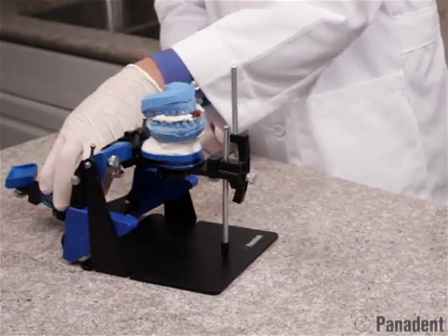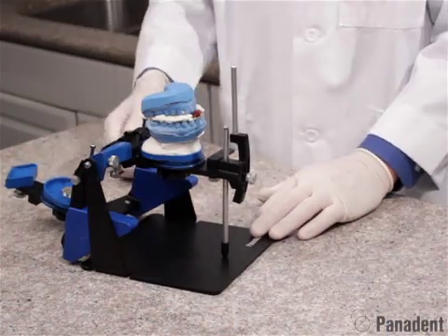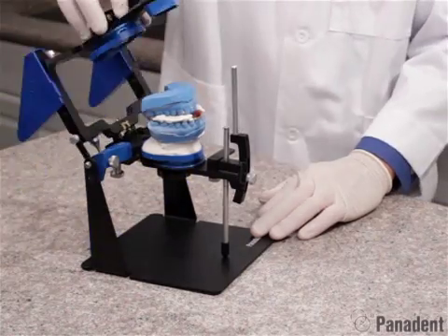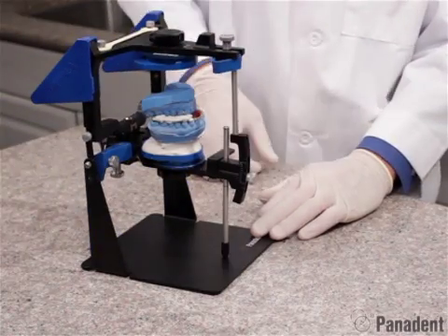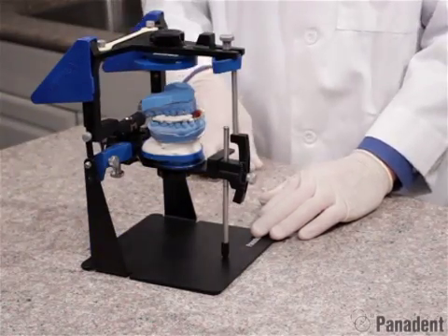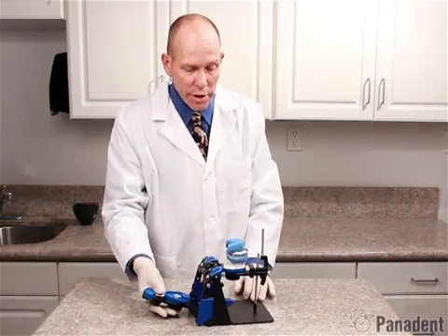We can then add a mounting plate to our lower frame here. We can add some plaster to the mounting plate and to the cast, swinging this around, making a connection of the lower cast to the lower frame of the articulator. So we'll go ahead and mix some plaster at this time.